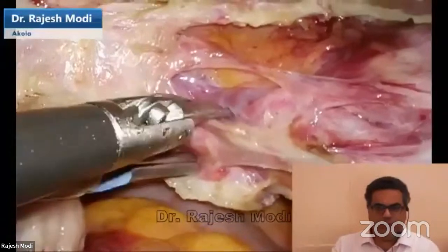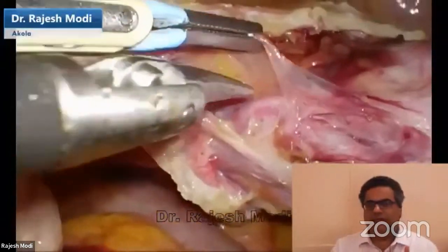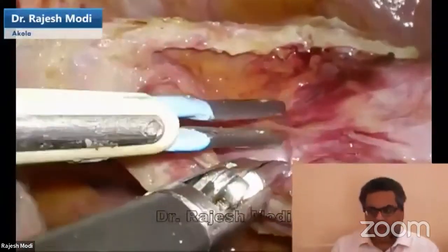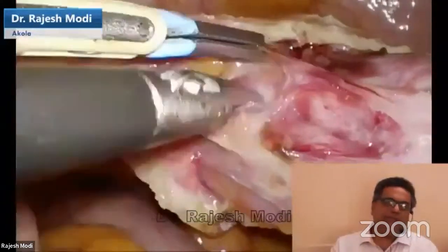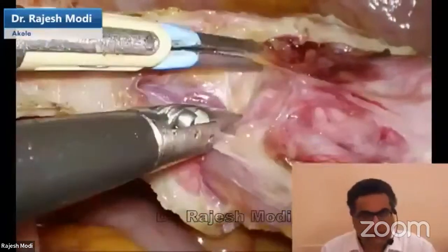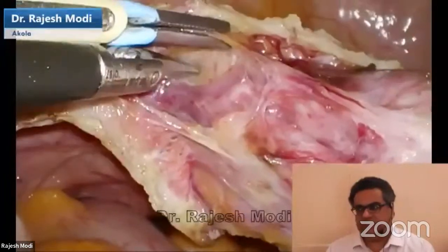It depends on you. What are you comfortable with? If you feel that you are happier or comfortable with a uterine manipulator, there is no problem. Use it. I am happy with the myoma screw. I feel because I am able to pull much better. I can control the traction with my own hands. It becomes easier for me.